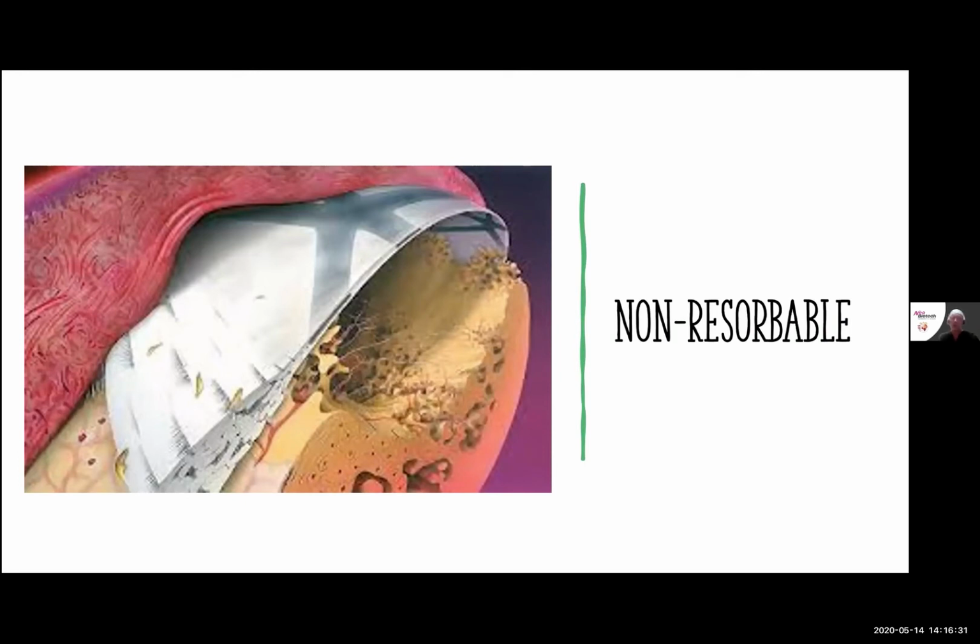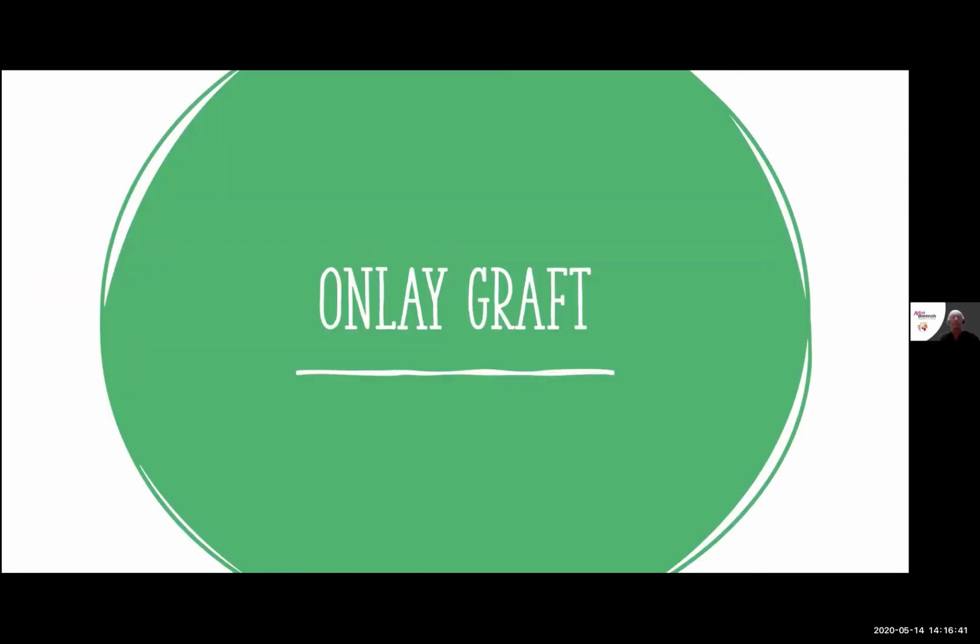And so using a non-resorbable will help to stabilize that bone graft and keep it from moving and changing its position and thus not incorporating. An onlay graft. I just barely saw a patient moments ago. The last patient I saw was one that had an onlay graft that was done by the military.